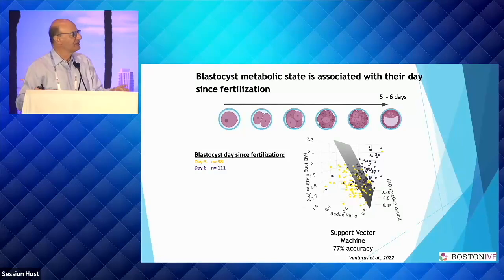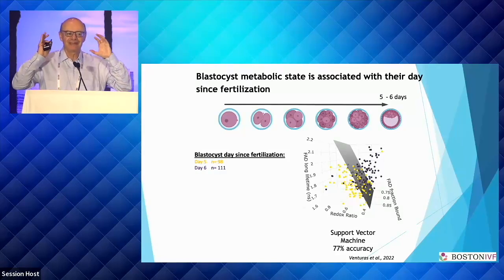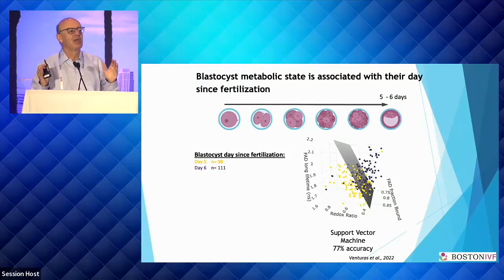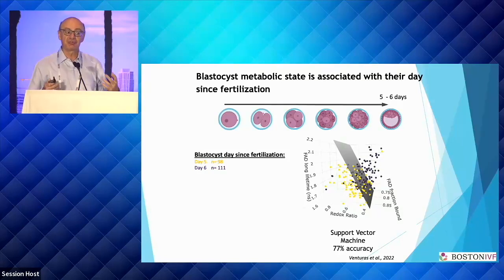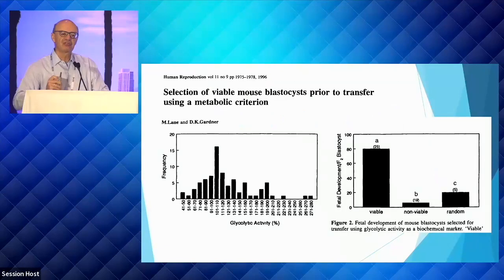We found that the embryo actually has an inside clock. It has its own circadian clock rhythm that knows it's day 5 and knows it's day 6. So this is fascinating when we talk about day 5 and day 6 embryos. Even though they were at different stages or morphologically different, day 5 and day 6 embryos are very different in what they know they're doing metabolically.